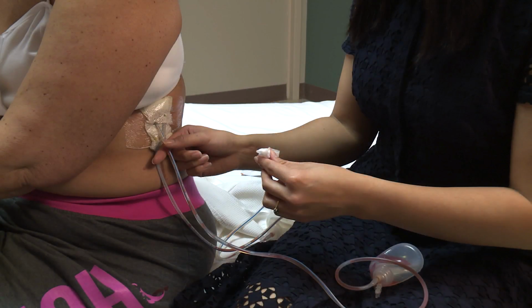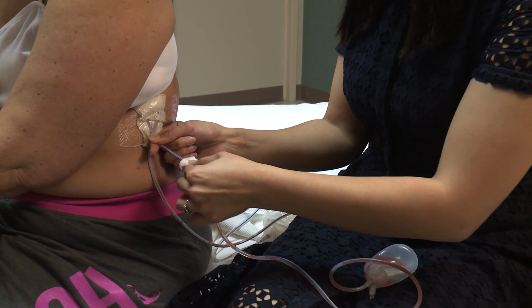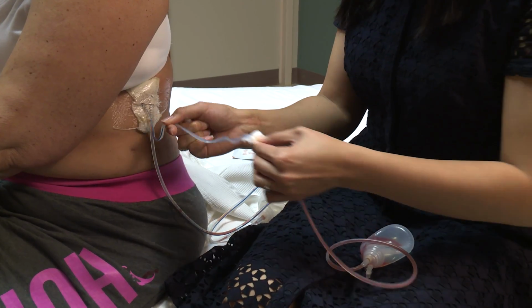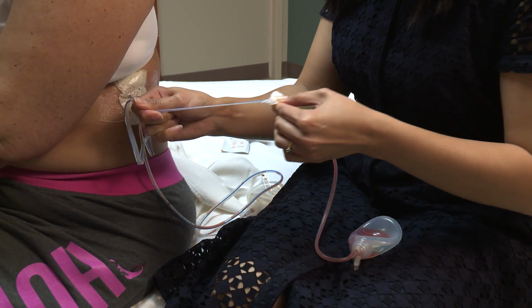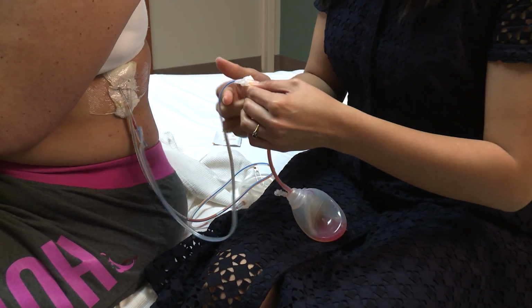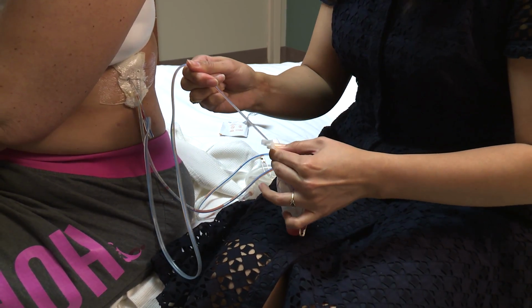With your non-dominant hand, firmly hold the drain without moving it near the skin at the drain insertion site. With your dominant hand, and close to the drain stitch, place an alcohol prep pad around the drain. With your thumb and first finger, gently pinch the drain with the alcohol prep pad and slide the alcohol prep pad down the entire length of the drain until your fingers meet the top of the bulb. The alcohol prep pad helps your fingers slide more easily along the tube.